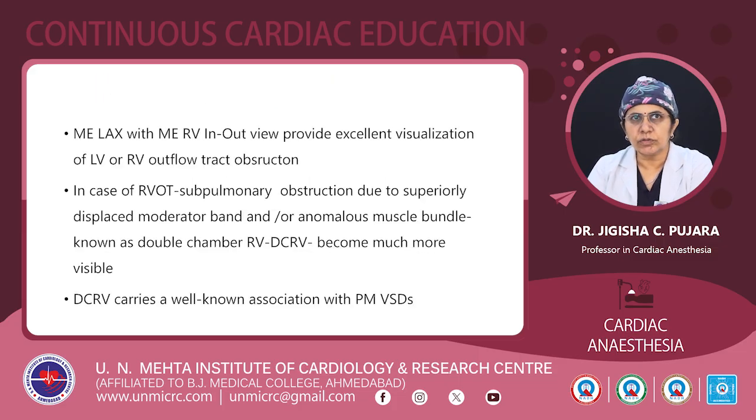The mid-esophageal long axis view with the mid-esophageal RV inflow-outflow view provides excellent visualization of LV and RV outflow tract obstruction. In the case of RVOT subpulmonary obstruction due to a superiorly displaced moderator band and/or an anomalous muscle bundle known as the double chamber RV, that is DCRV, becomes much more visible in this view.